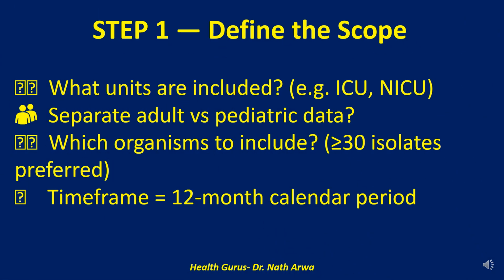Okay, let's build an antibiogram, step by step. Step 1. It all starts with a solid foundation. You have to define the scope. First, ask yourself, which hospital units are you including? Just the ICU, the NICU, or the entire hospital?